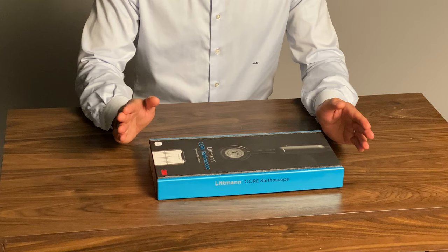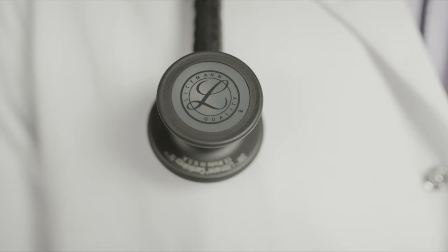Hello everyone, my name is Dr. Ali Haider and I'm an interventional cardiologist. What I have with me today is a product I'm very excited about — it's a collaboration between 3M and ECHO, and it is the 3M Littmann Core Digital Stethoscope.